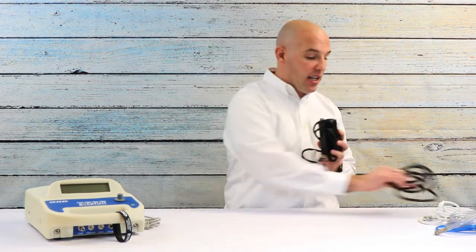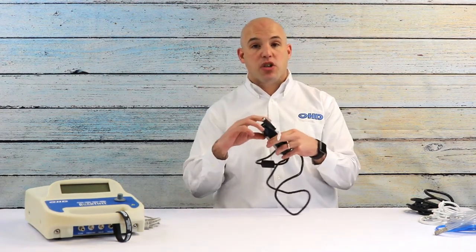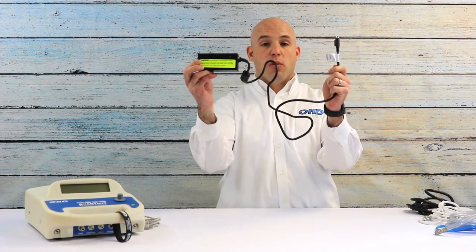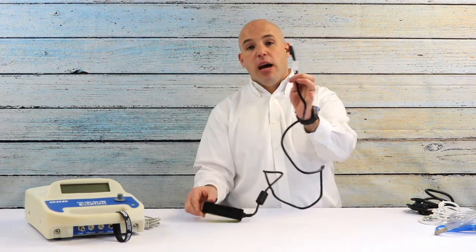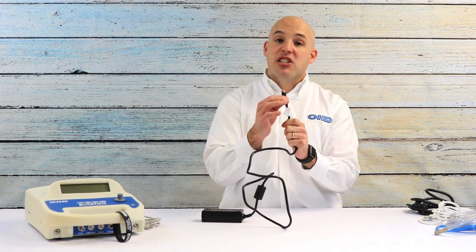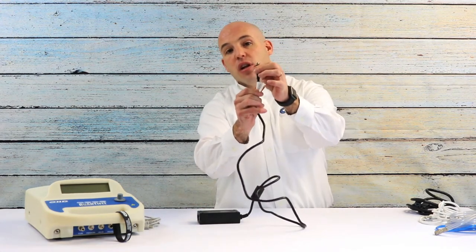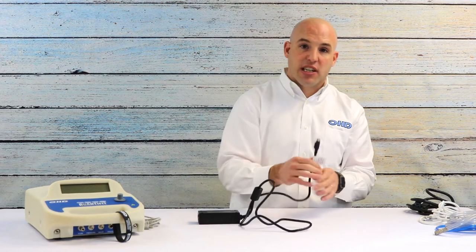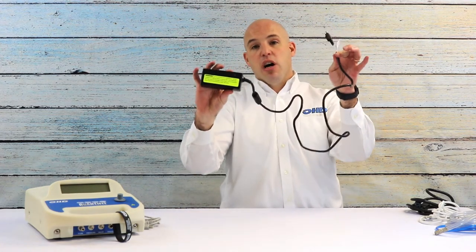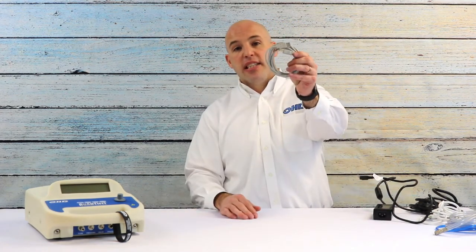Next we have a power cable and transformer box. The power cable runs from the outlet to the transformer box, which then runs to the back of the Quantifit. A quick heads up: there are warning stickers on the transformer box because when you plug it into the back of the Quantifit, it actually locks in — it doesn't just plug in. There is a quick connect at the end that you must utilize to unplug the device, otherwise you can harm the connector by forcing it out.